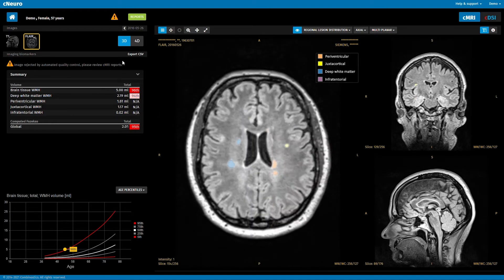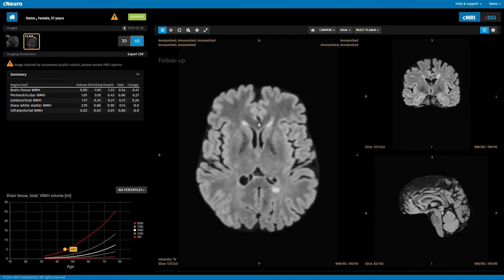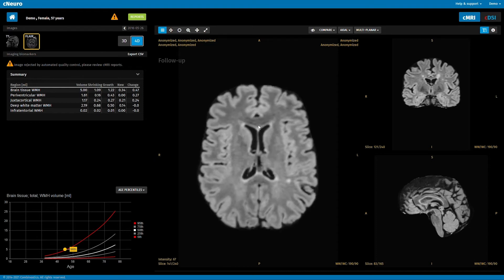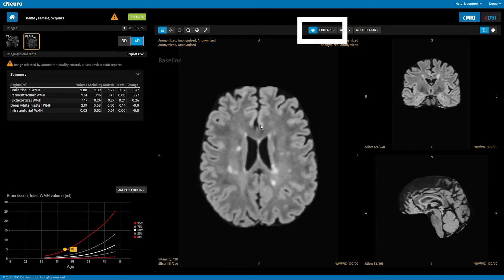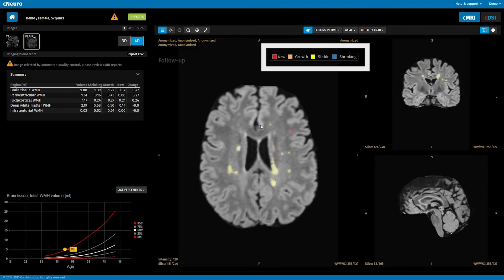If you have longitudinal data, you can compare the follow-up scan with the baseline scan. You can toggle between the scans, and you can review lesions marked as shrinking, stable, growing, or new.